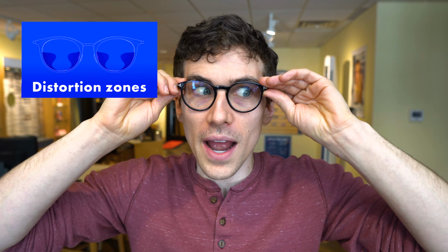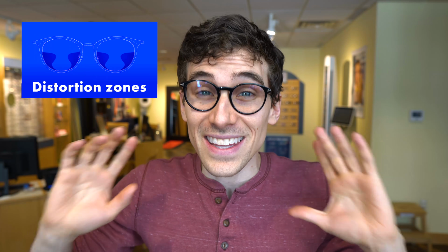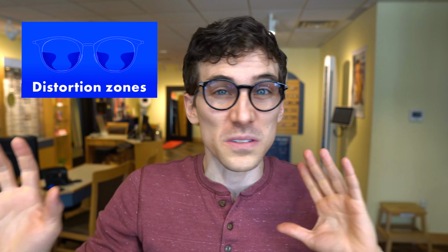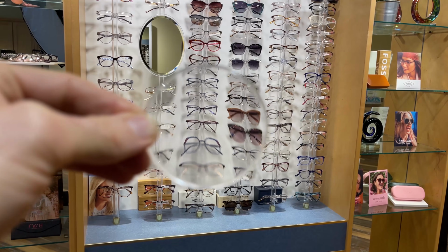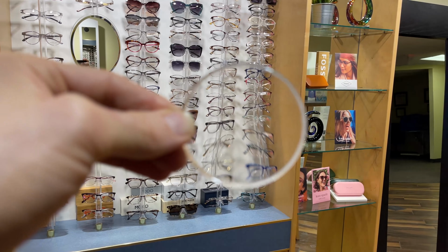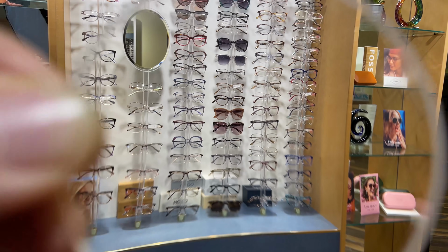You see, progressive lenses have these distortion zones off to the sides and kind of in between. And if you happen to shift your eyes to look at something and you look through that distortion zone, things are gonna feel even more weird, off, and blurry. So all of the usable magnification in progressive lenses is really right in the middle. So if you're looking at a computer screen, point your nose at the computer screen. If you're gonna be reading a note, a medication, or your phone, you wanna, again, face directly at the object that you're looking at.